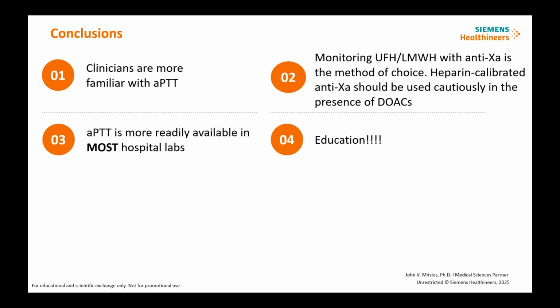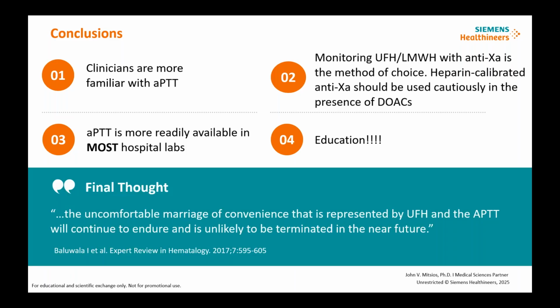Here's what the lab has. Here are some of the advances that have been currently made. This is where we can access and what we can do today. And as I was reading through and preparing for some of this talk, I ran across this sentence in a paper: the uncomfortable marriage of convenience that is represented by unfractionated heparin and the APTT will continue to endure and is unlikely to be terminated in the near future.